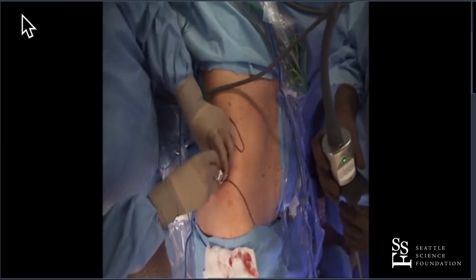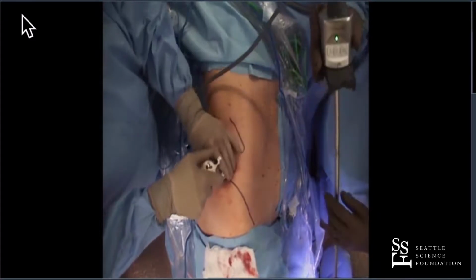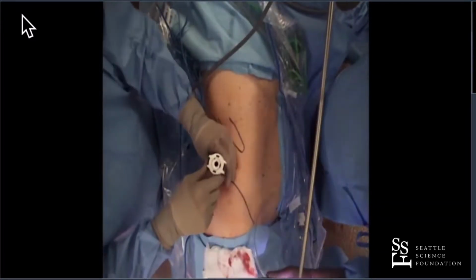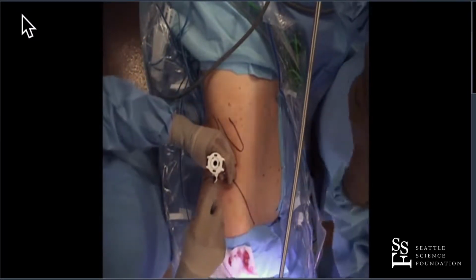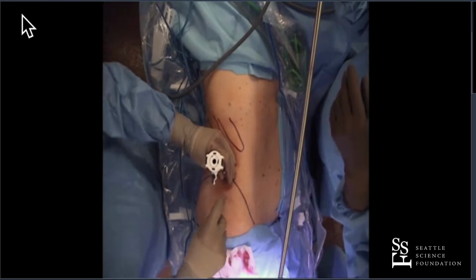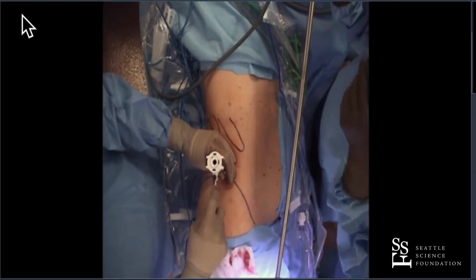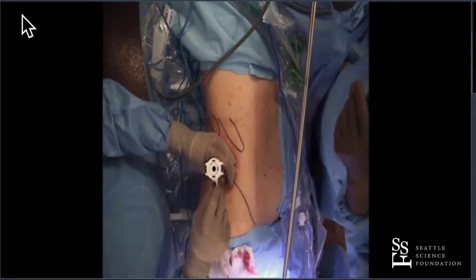So we're going to put it through our, she's got some thick obliques. She's pretty athletic, I believe, for a nurse. Ouch. I think she does a lot of yoga. Can I have, let's have the CO2, please. Go to 40. Jim, our nurses in Ohio all look like that. They're all very fit. Yep.